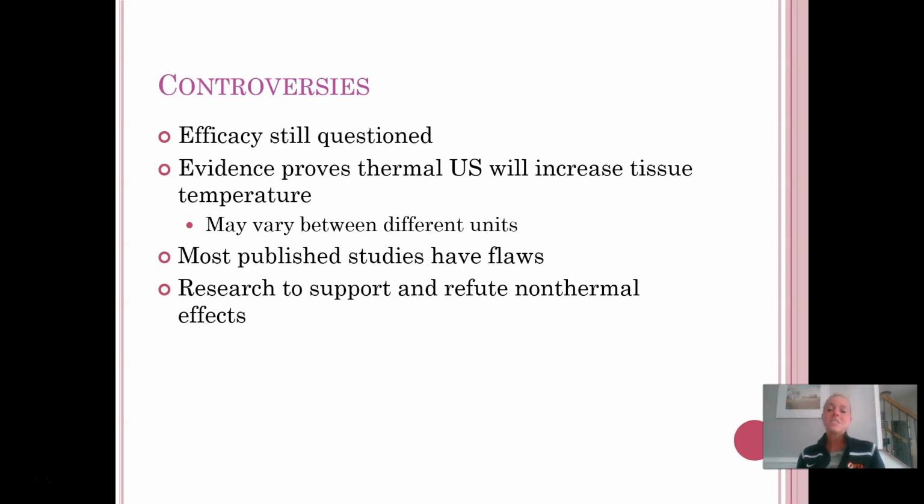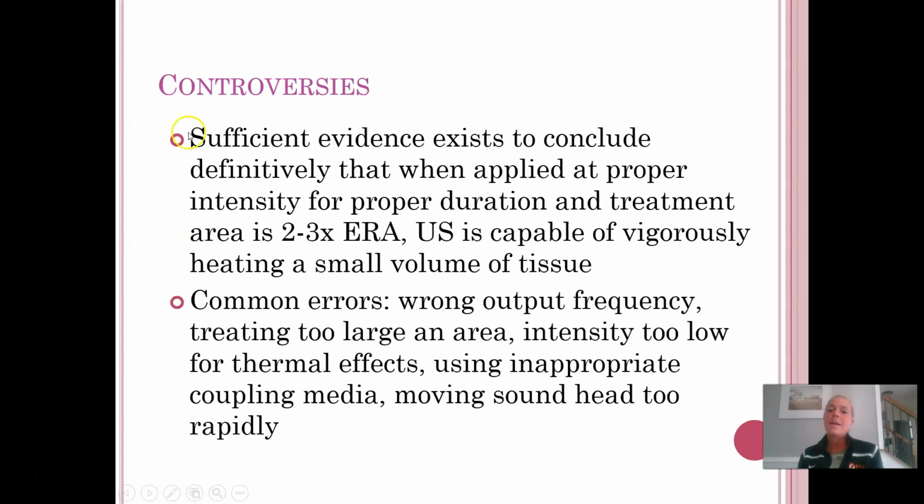A lot of the published studies have flaws. We'll get into it, there's another slide that talks about some of the things that are commonly done wrong with ultrasound studies. Again, thermal effects are pretty well supported. It's the non-thermal effects where we still need some more research. Again, there is good evidence out there that definitively supports that if ultrasound is done properly, it is capable of vigorously heating a small area.